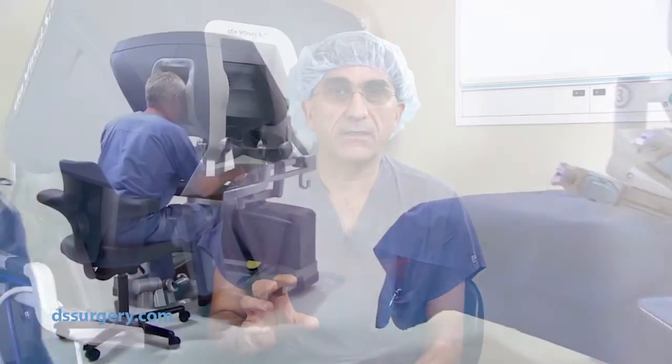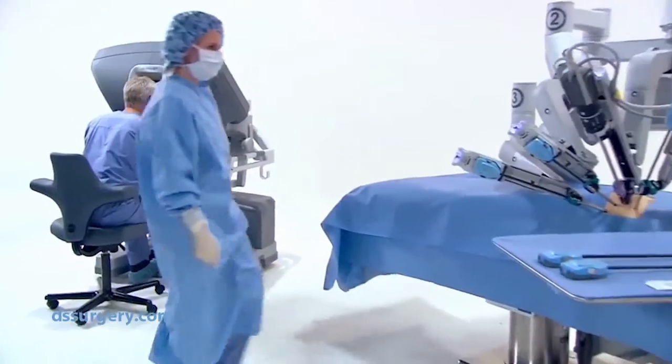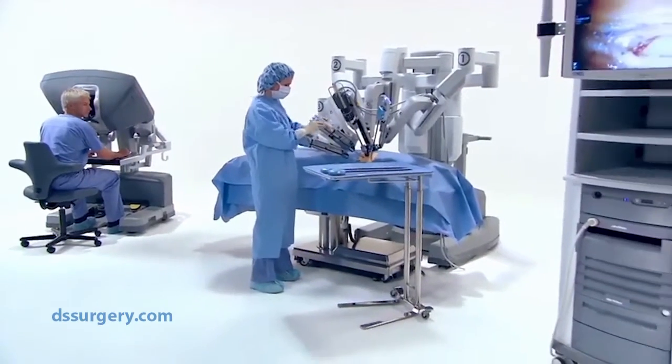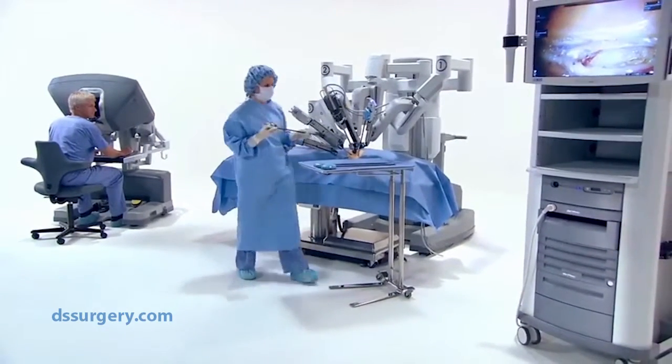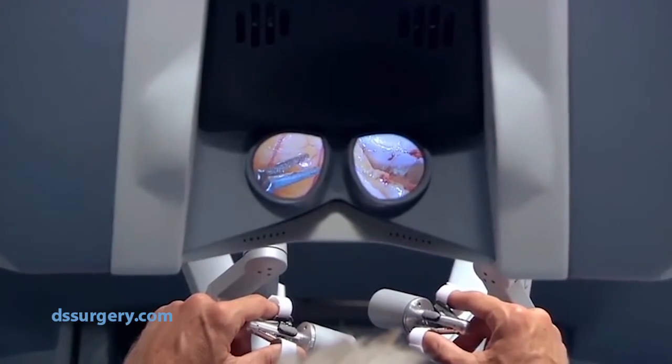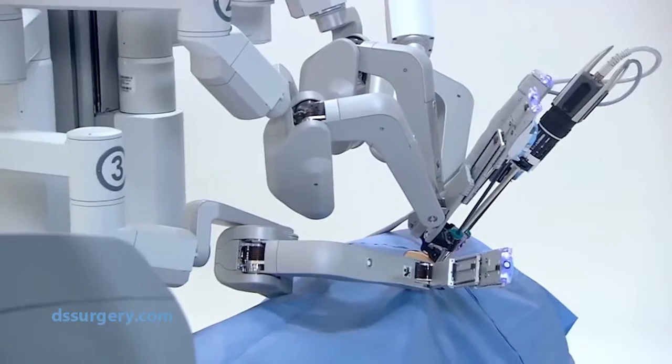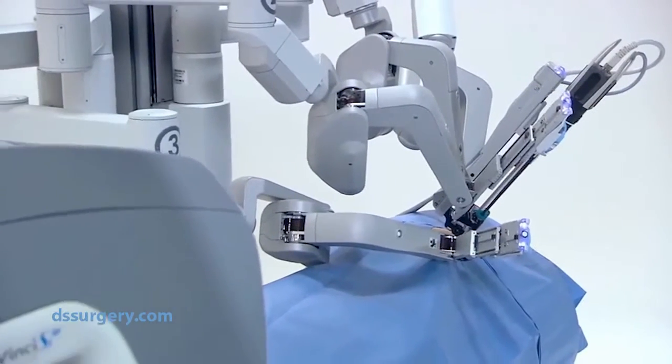In robotics, the surgeon steps away at this point, and a docking instrument is brought to the operative table. That docking instrument essentially holds the camera and the instrumentation, which is manipulated by a surgeon's console that acts as a remotely operated device to allow the surgeon to manipulate the instruments.